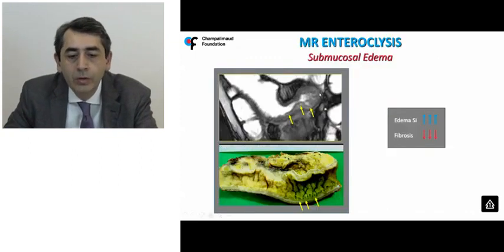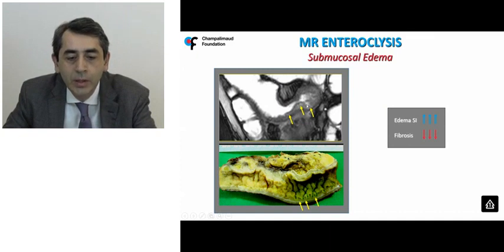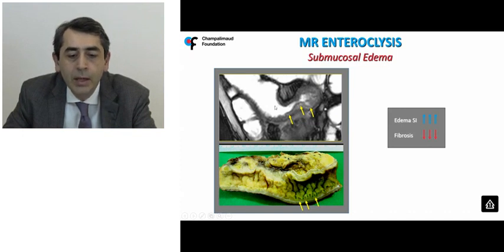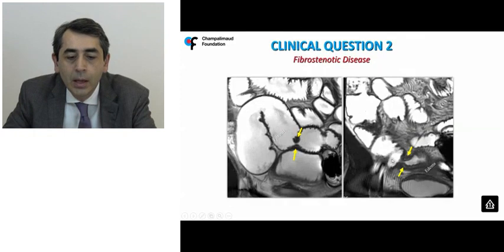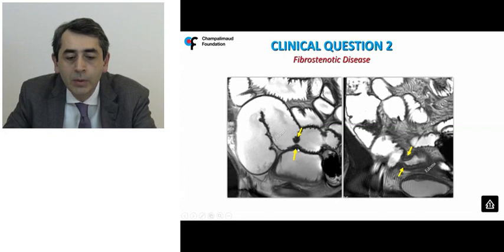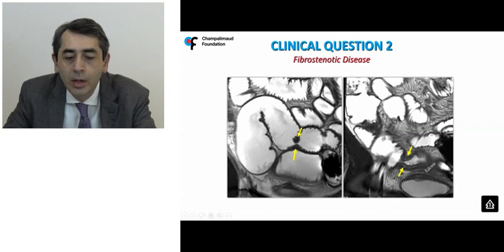Active disease can also be detected by submucosal edema appearing very bright on T2 or T2-like images such as TruFISP, versus moderate or low signal intensity in more fibrotic areas. The presence of multiple ulcerations — the so-called cobblestoning — has also been correlated with active disease. Discriminating between fibrostenotic disease and soft-type strictures is important, as they have completely different treatment management.